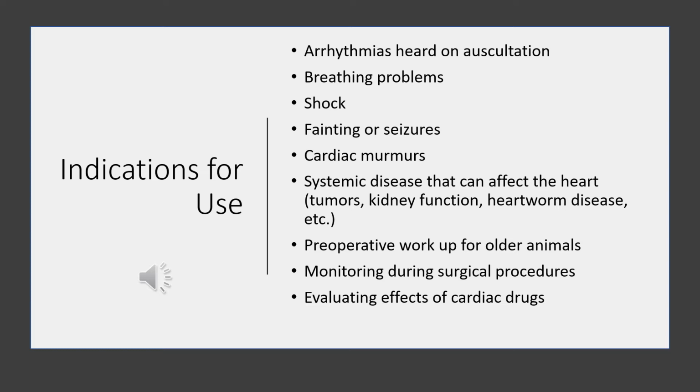We can also use this machine to evaluate the effects of cardiac drugs, assess the degree of heart strain in patients with systemic diseases, as well as the obvious monitoring of our patients that are under the care of surgery, or assess their heart to determine if surgery is even a safe option.